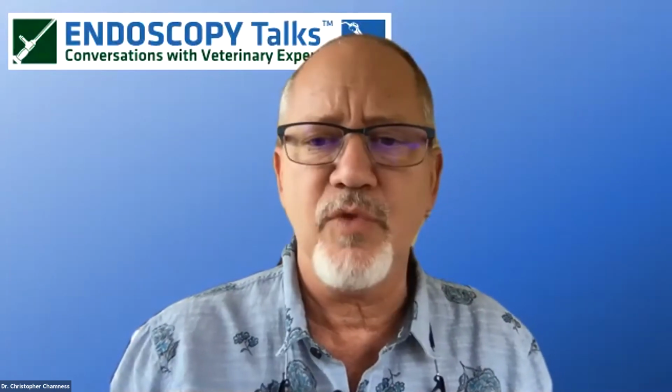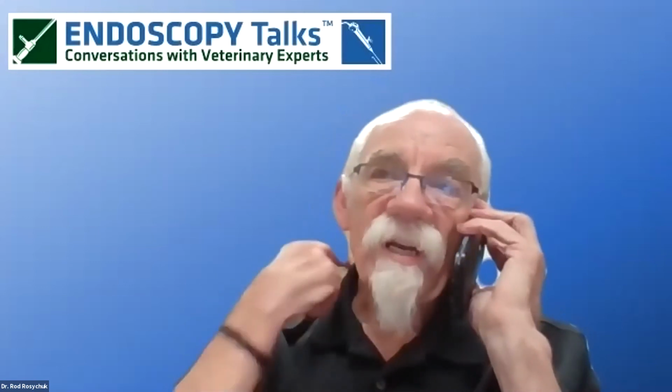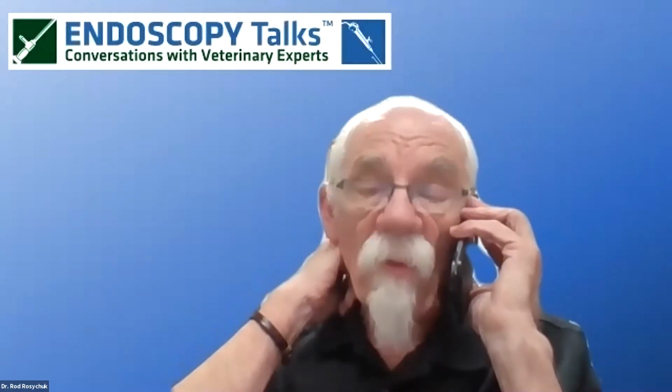In very diseased ears, it's sometimes difficult to appreciate where the tympanic membrane would have been. How concerned should we be about inadvertently pushing material from the external ear into the middle ear? In our GP clinic, we often stop once we feel like we've reached the middle ear for fear of doing more damage. Well, you do have to respect the fact that you can traumatize the tympanum, obviously.